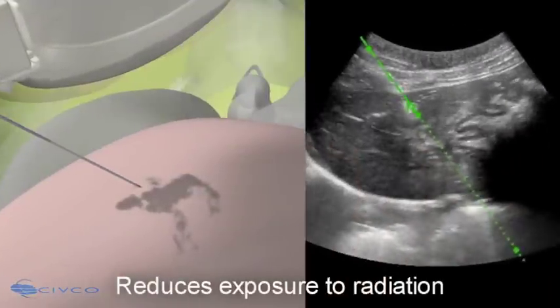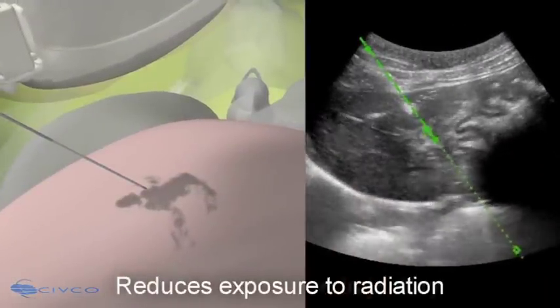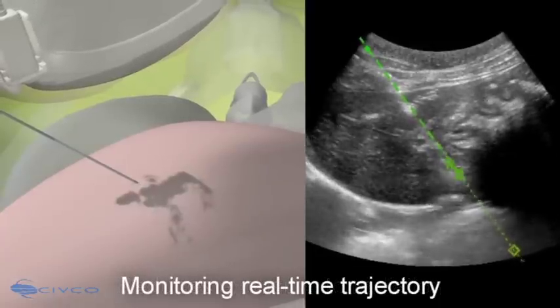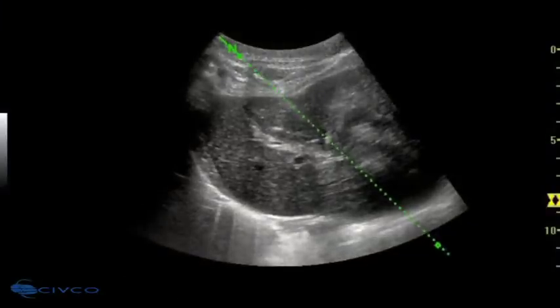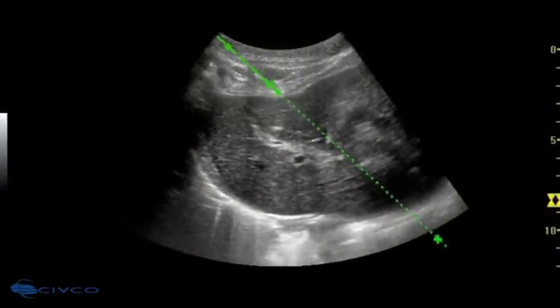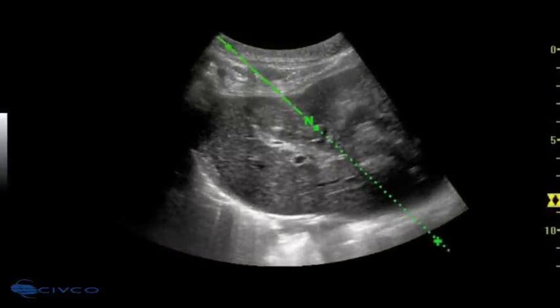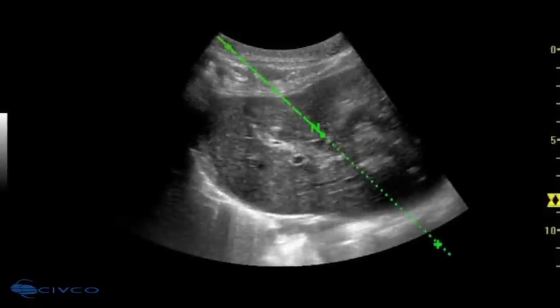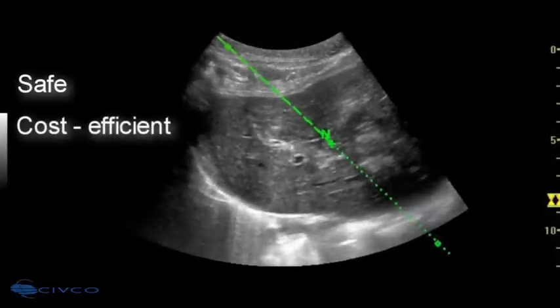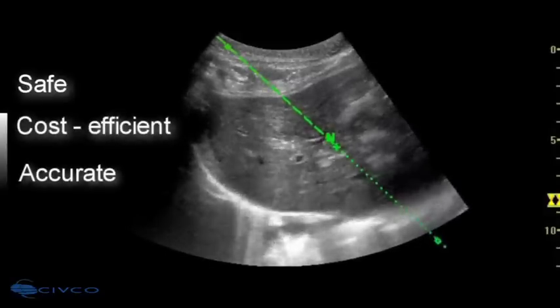Performing such procedures utilizing E-Trax and ultrasound reduces exposure to radiation. Monitoring real-time needle trajectory through delicate anatomy enables the user to target difficult-to-access lesions. As you can see, the location and orientation of the needle is clearly displayed, resulting in a safe and cost-efficient procedure with accurate targeting of lesions.